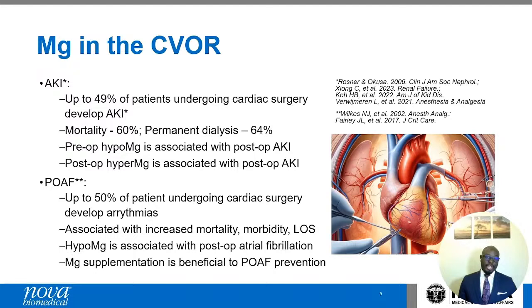So if you can measure ionized magnesium, the more physiologically active part, and also do it in the OR more effectively, then you can better serve these patients by reacting to the levels of magnesium that you get in the moment.